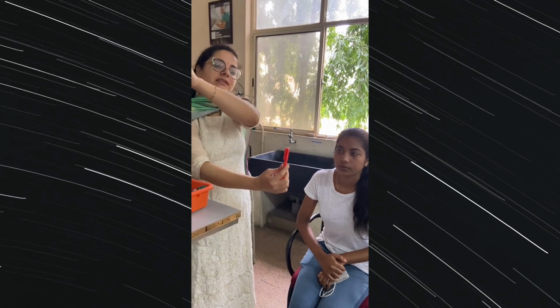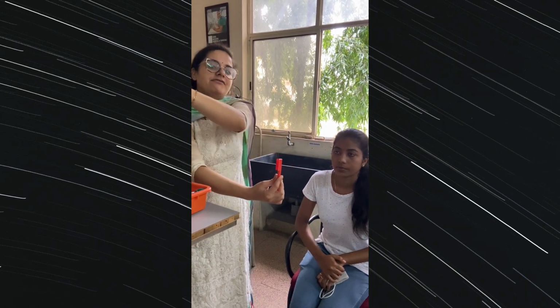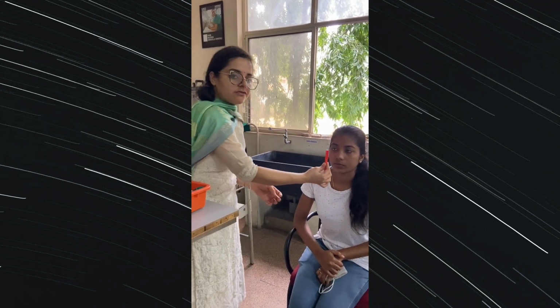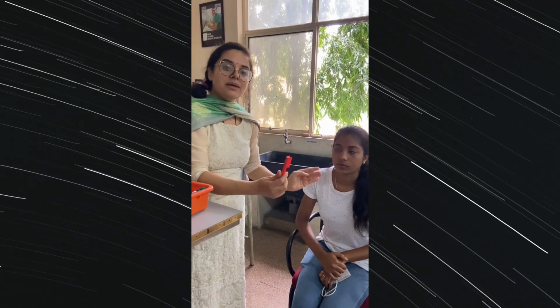Okay, so when I make the patient look at the tip and then at the far away wall, the pupil is constricted here and dilated when looking far away. And when I take a pen light source to the nose of the patient, again the pupil is constricted, because the object is very nearby, so there is no need to dilate. Now it will be constricting.